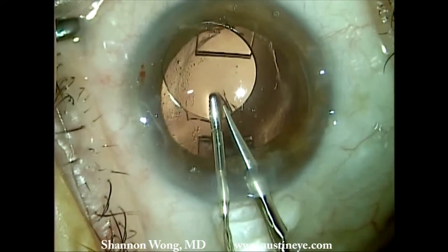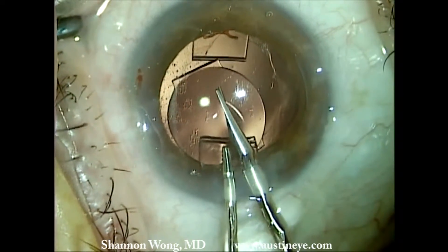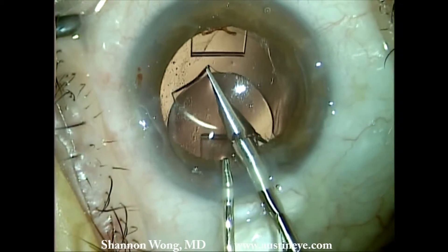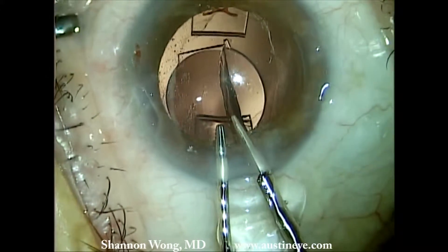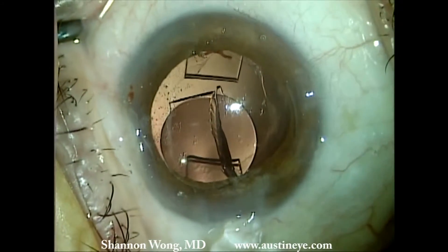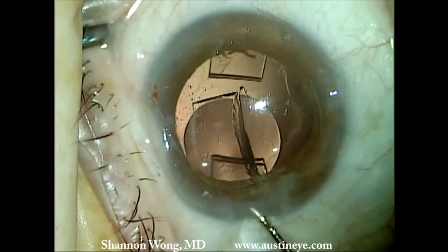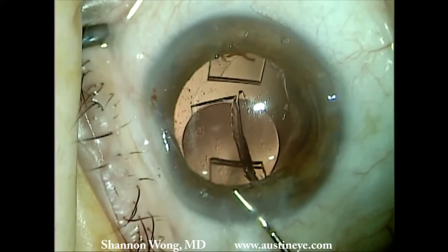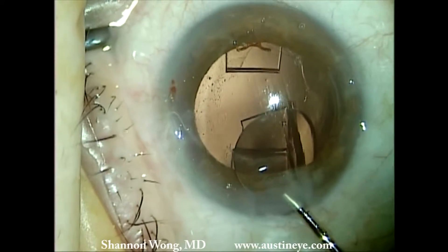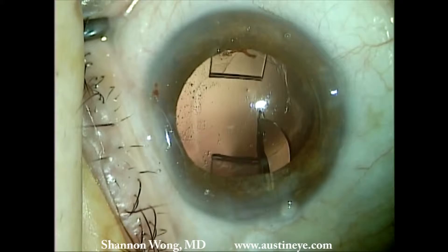We're using micro forceps and micro scissors made by MST Microsurgical. We've placed a generous amount of viscoelastic behind the IOL optic to move the posterior capsule as far away from the area of interest as possible, in order to prevent inadvertent perforation of the posterior capsule.